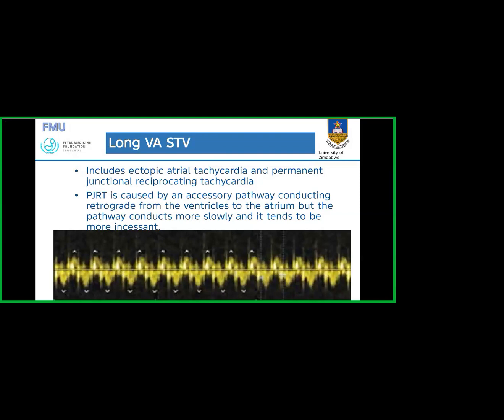So from this graph, you can see that there's separation between the atrial contraction and the ventricular contraction, which is a bit different from the previous one where we had a short VA, when the atrial contraction occurred almost simultaneously with the ventricular contraction.